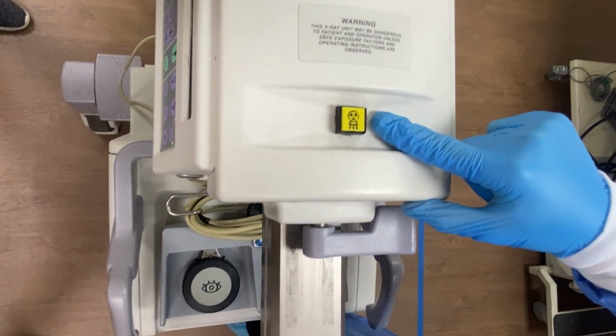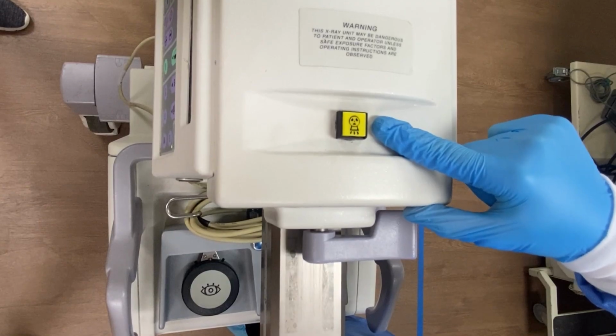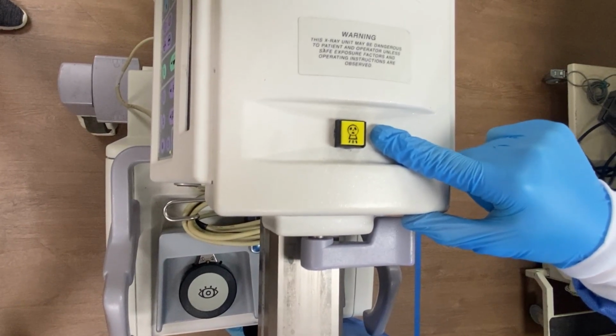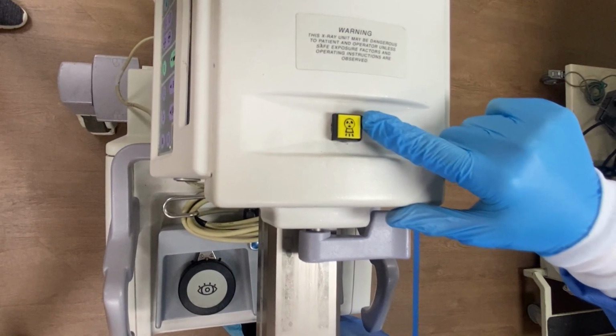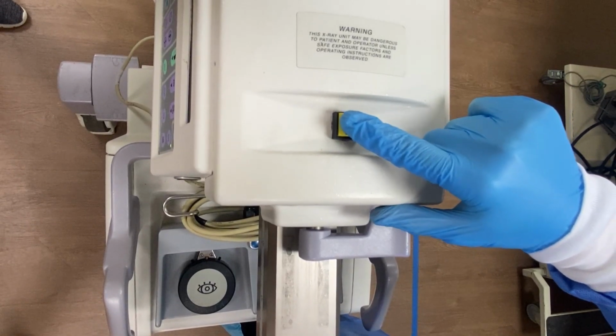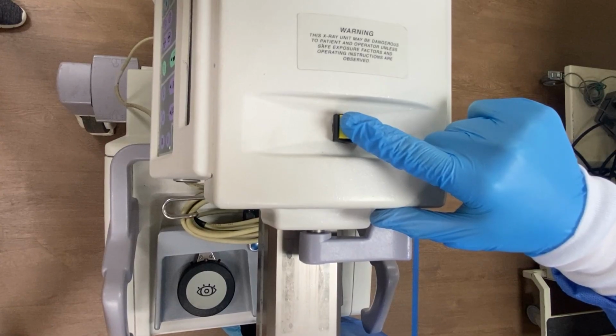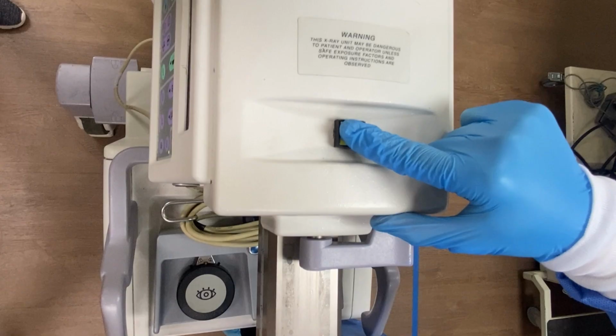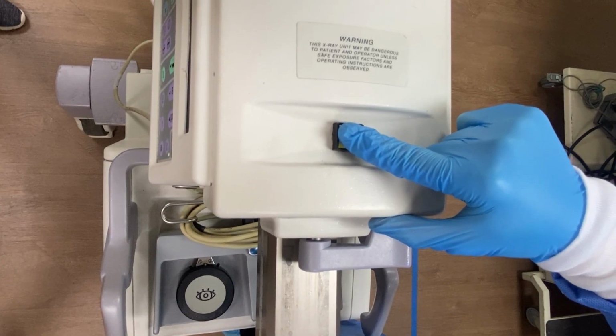This is the exposure button. It is located on the top of the base of the C-arm. With one click, it will take one image, and if you hold on to this button, it will fluoro and show us real-time moving images. It's important to have your hand close to this button when the C-arm is positioned over the patient, so we are always ready to show the surgeon an image as soon as they need it.